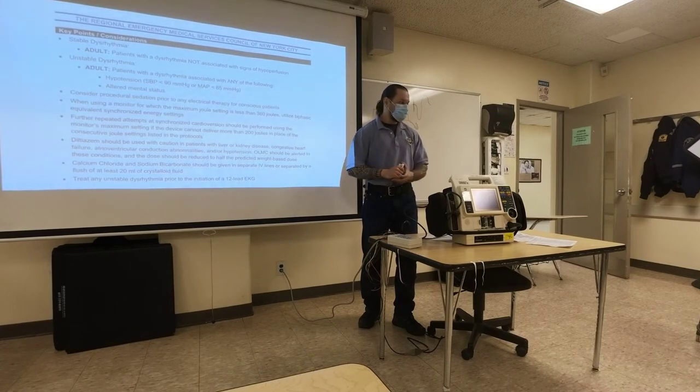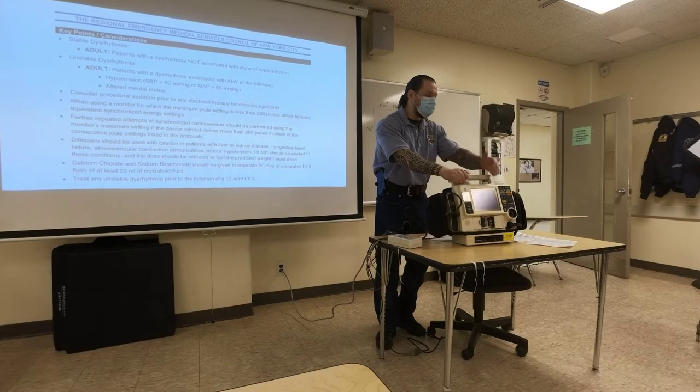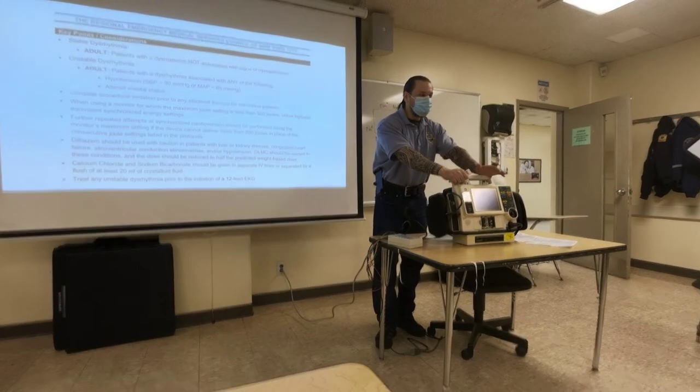But don't we do it before, after? Yeah. I would say do it before. If you're doing pacing, do it before, right? So get your thing done. Or if you haven't done it, at least tell the hospital staff we don't have a diagnostic 12-lead EKG. So make sure you run your own 12-lead EKG before you switch them to your own pacemaker, right? So you definitely want to have a baseline 12-lead, right?